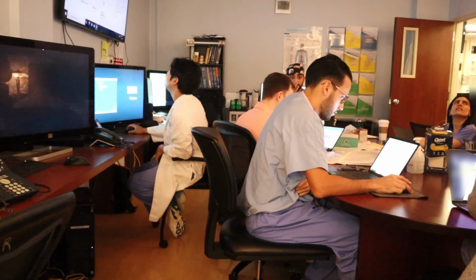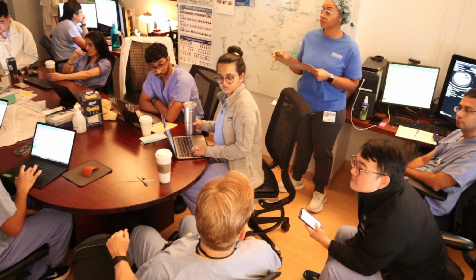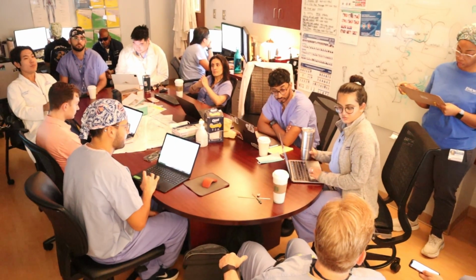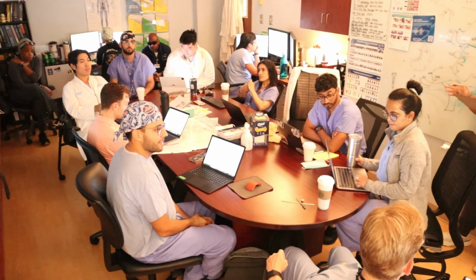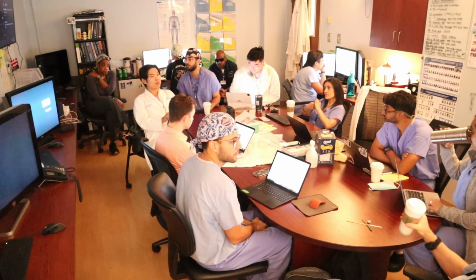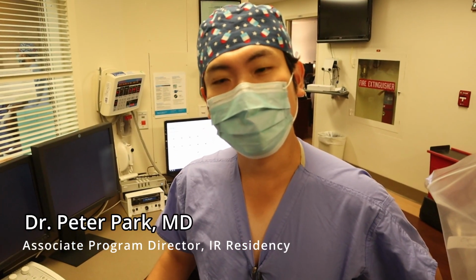Now we'll meet Dr. Park, who will brief us on how a gastrostomy tube is placed directly through the skin of the abdomen and into the stomach, so that food and medications can be delivered into patients who can no longer swallow normally. I'm Peter Park, one of the IR attendings here at Emory.